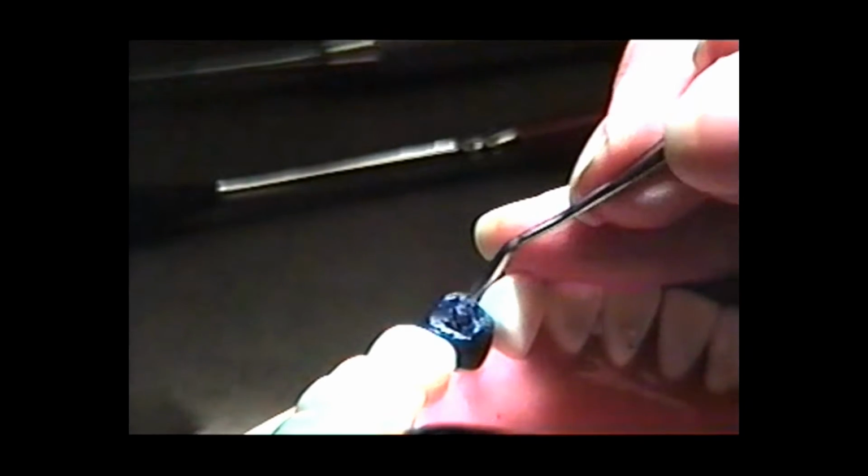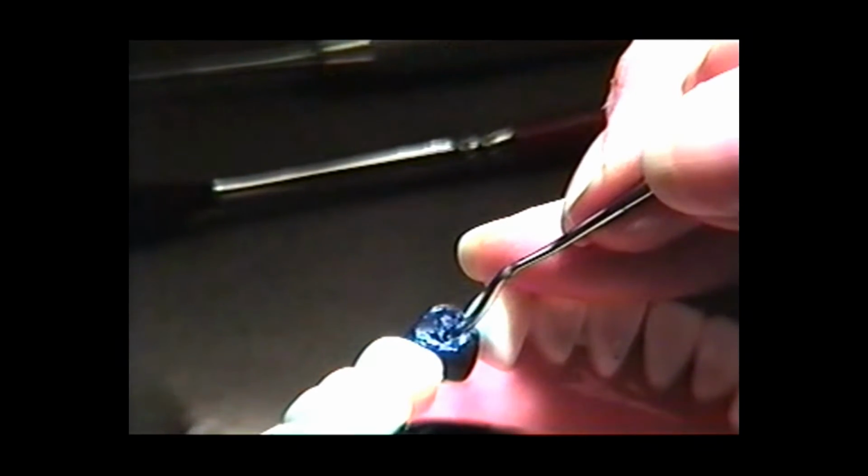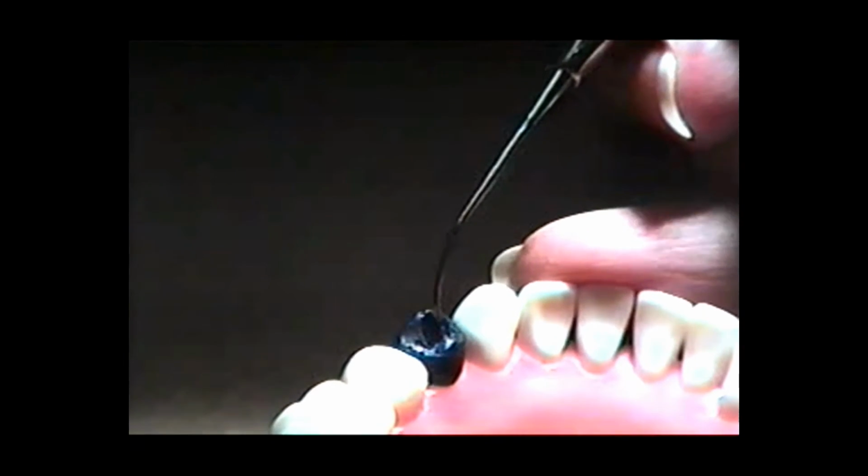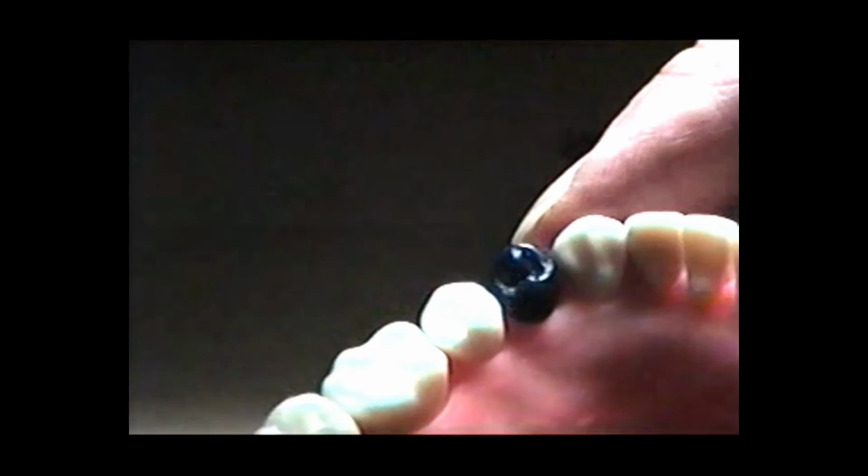It's not quite right. You have to add. If you find out that it's not the way you want it and you need to add, just add a little at a time. So use that narrowest little dripper, and add where you need it. Sometimes you don't even need to carve it back because your addition is so convex because of the way the wax lays on the tooth. You've got a really nice looking marginal or triangular ridge there all of a sudden.